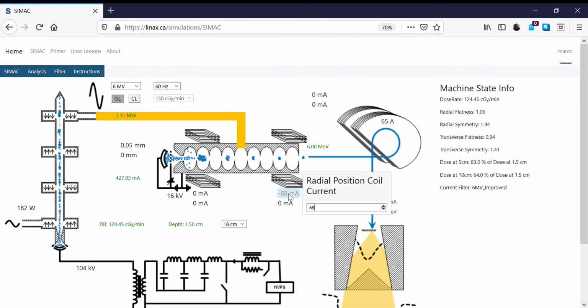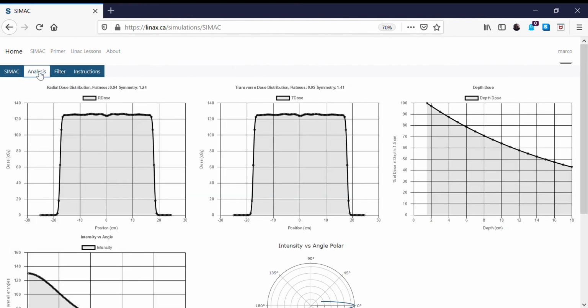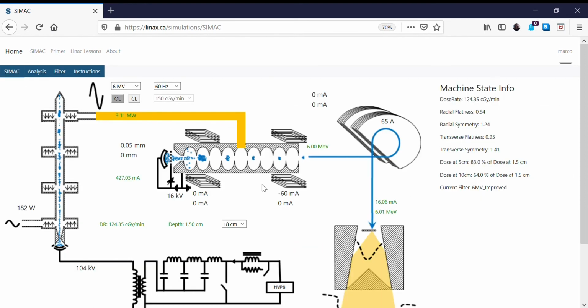I'm going to increase this back, so let's try minus 60. Minus 60 is producing a symmetry of 1.24. So minus 60 and minus 50 seem to produce about the same number. This is how SIMAC can investigate the symmetry problems with beams. We can simulate a beam error, then we can see how we can correct it.